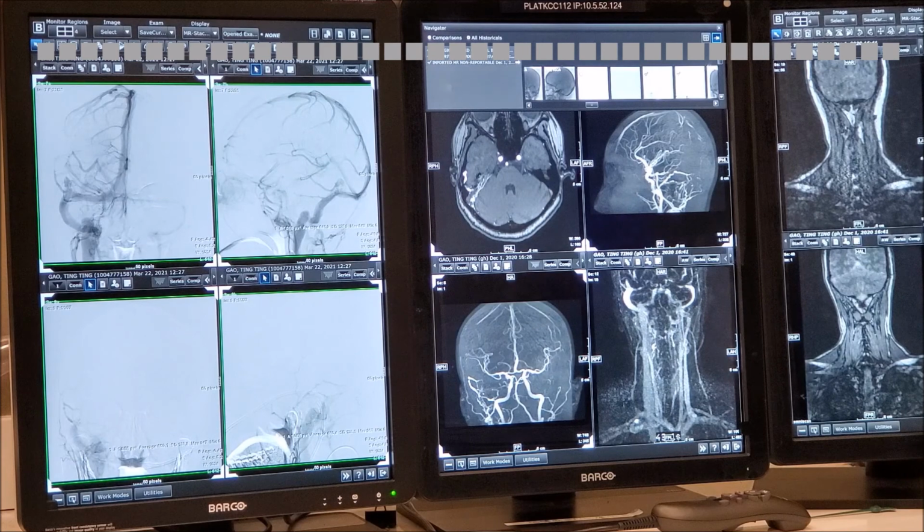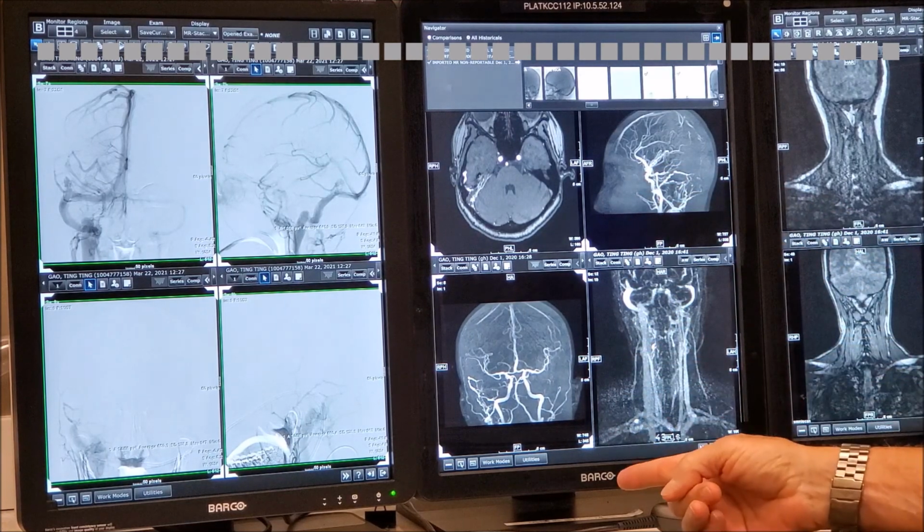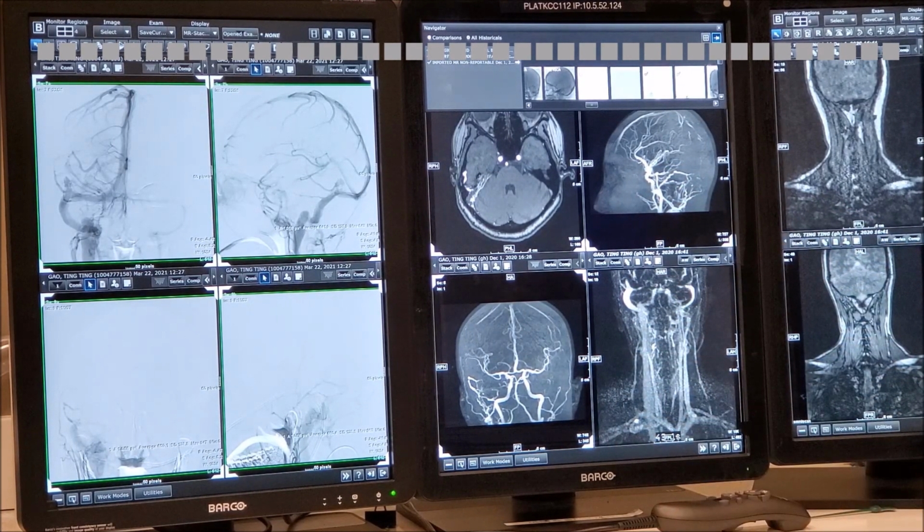Do you remember if the patients are awake or sedated? Sometimes sedation is your worst enemy because they kind of sleep. One thing that works very well is to train with the patient first. You tell the patient, when I put my finger down, you should hold, but not before.